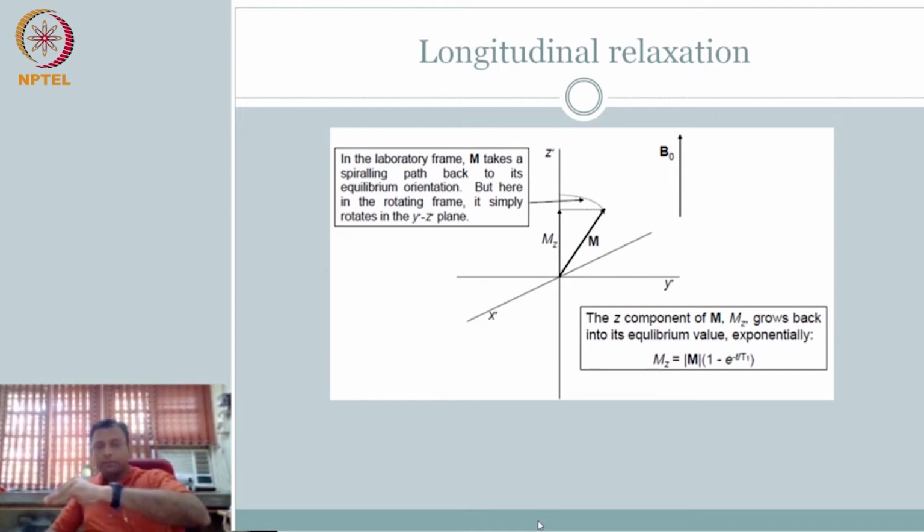One way to do it is, well, what is the meaning of this dephasing? Remember, why is it dephasing? Because some nucleons, some vectors, some nucleus are moving faster, some are moving slower, slightly up and down the Larmor frequency. So what happens is they start to move away from each other. So now if I give another command, right, and say, oh, whoever is moving fast, you start to slow.